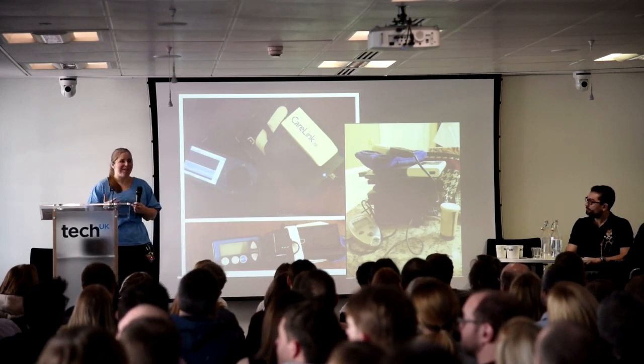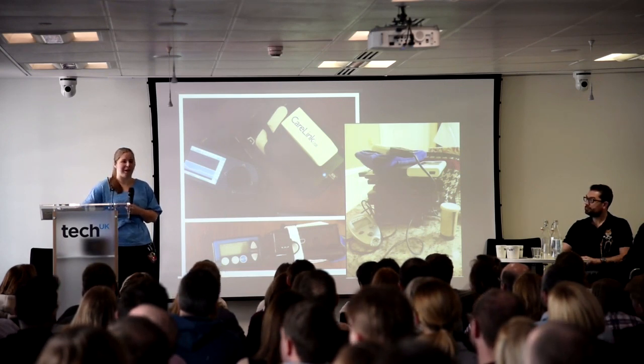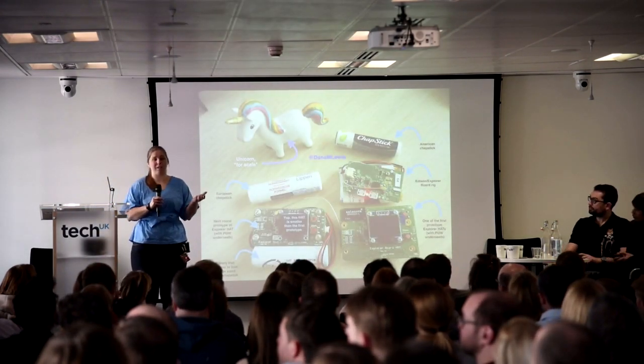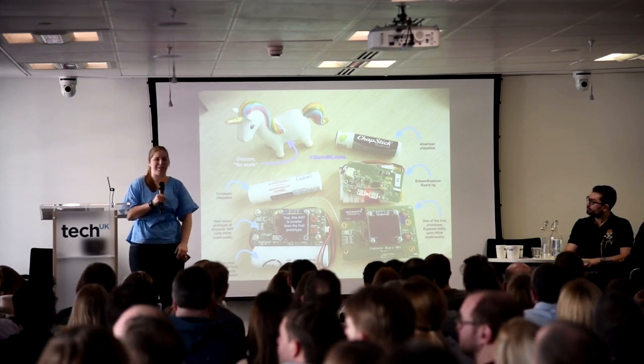But there's actually somebody here based in the UK, Oscar Pearson, who said, you know what, I'd love to find a way to use a better radio to make this smaller for my wife. And so because of his work, we've been able to downsize to what we call the Edison Explorer rig, which is what's on the top right with an American chapstick for size context.